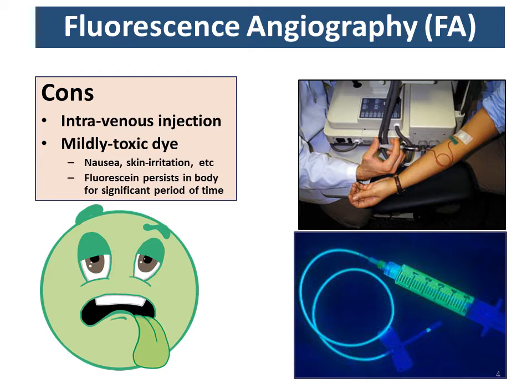And speaking to Andy McNaught, who's not here today but was here yesterday, he also mentions that this presents a risk that needs to be considered when addressing a patient's needs if they have complications with other internal organs such as the kidneys. Then you really need to consider the risk of doing a fluorescence angiography, the risk-benefit analysis.